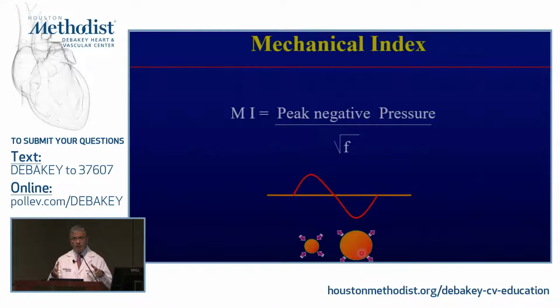So if you want to destroy, you image at your regular, which is 1.5 mechanical index. You can destroy a lot of microbubbles, and we're going to go through them. It's not going to look appealing to you because it's fragmented, it is black and white, it doesn't opacify the ventricle well. So you need to recognize this.